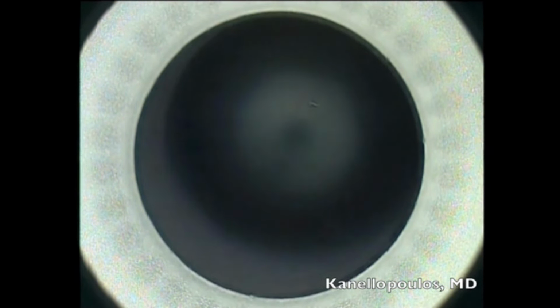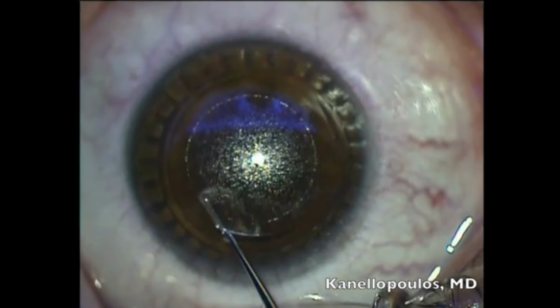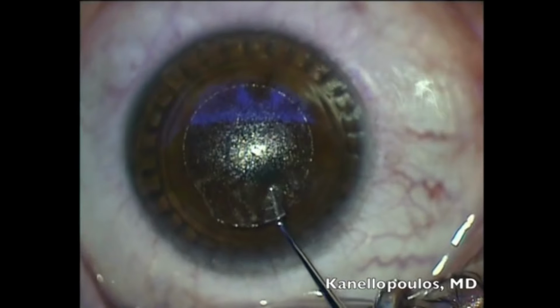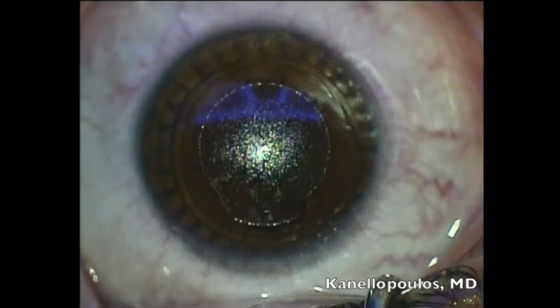After thorough training by the Zeiss team, and I thank you very much for that, I was able, this is one of my first cases, to go in with this disposable single-use spatula and find the space over the superior incision, and then go to my right here, which is obviously the patient's left side, and find the space, very important, inferior to the deeper inferior refractive incision. And you can see how the lenticule edge is seen over my spatula.